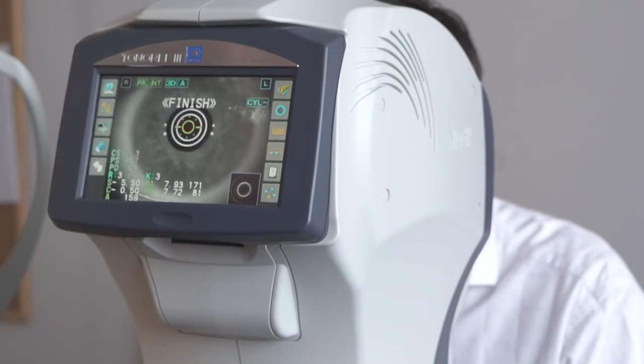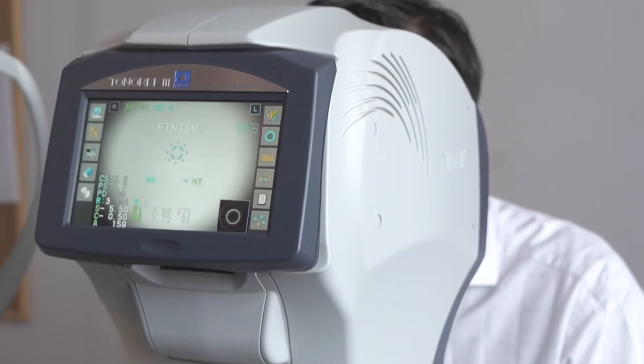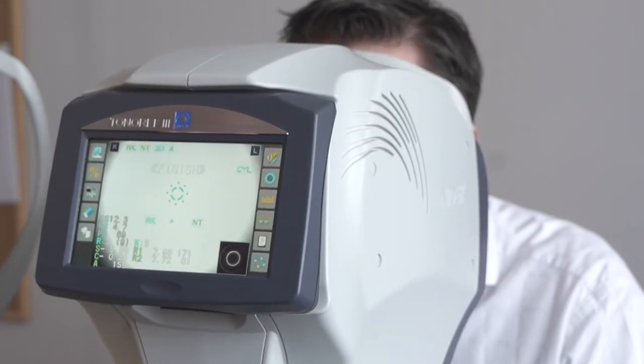Once it says finish, you can pull the machine back and it will dip down automatically to move on to our pachymetry and tonometry readings.